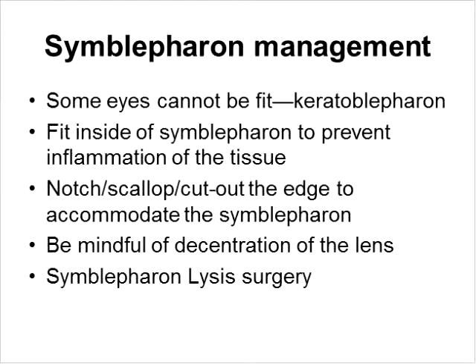Another helpful tool is to actually notch or scallop or cut out the edge to accommodate the symblepharon. But when you do that, you also have to be very careful of how far in you notch. One, you can notch too much and have air extrusion and bubble extrusion underneath the chamber of the lens.